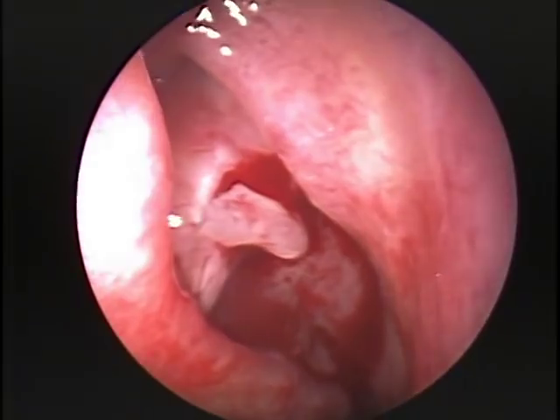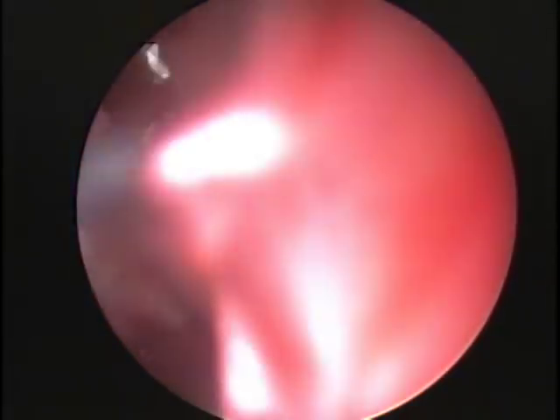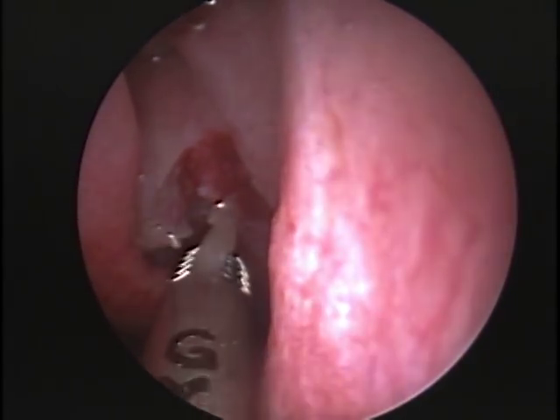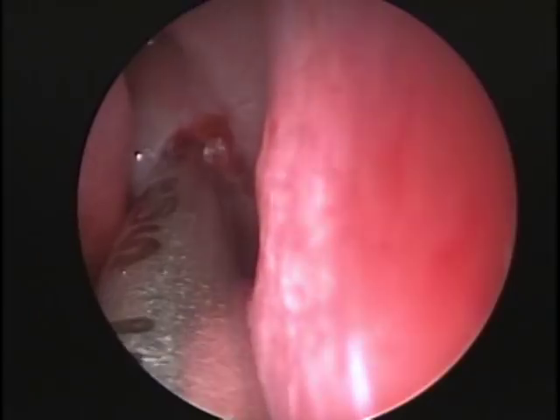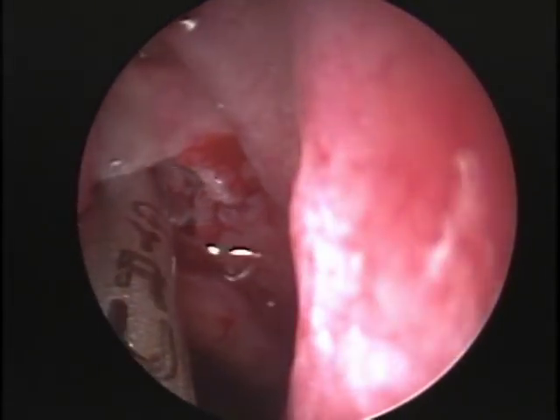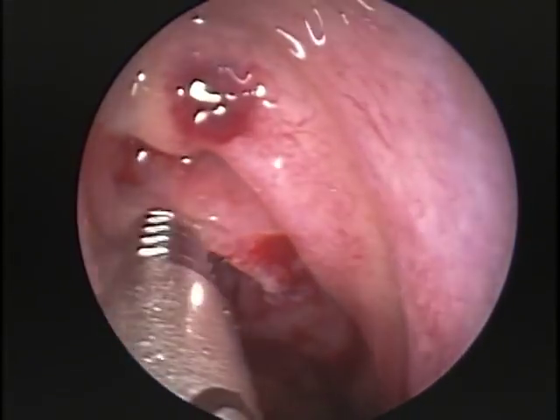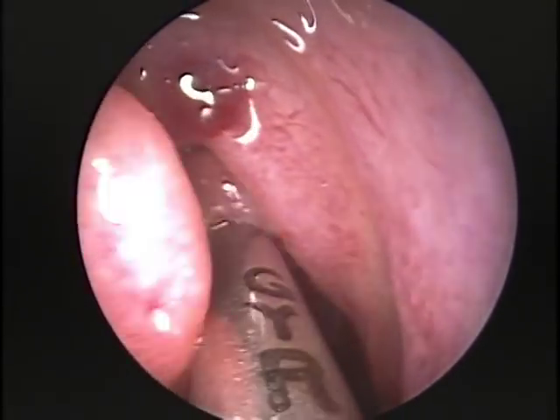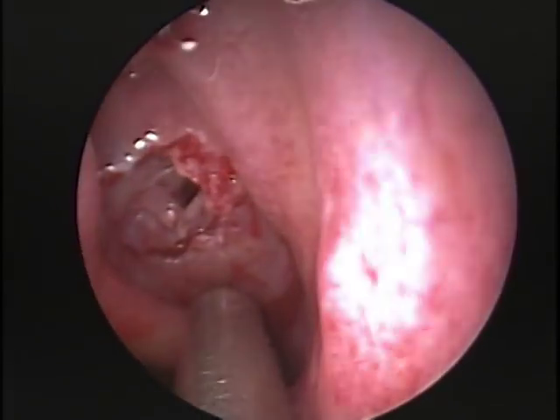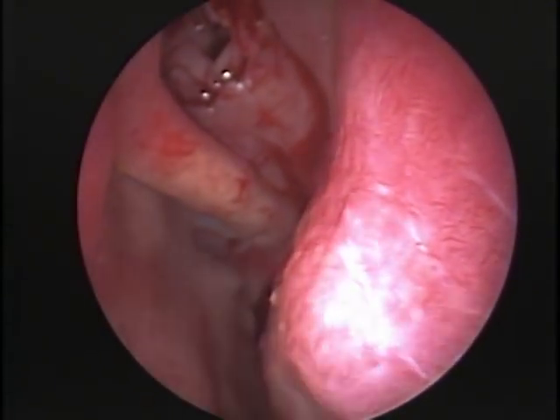In order to prevent recurrence we are going to open up the ethmoidal bulla using the Diego shaver. That is the origin of the polyp, and the procedure is now complete.